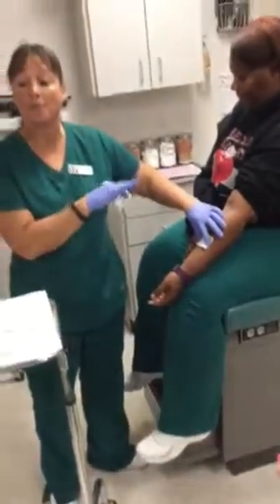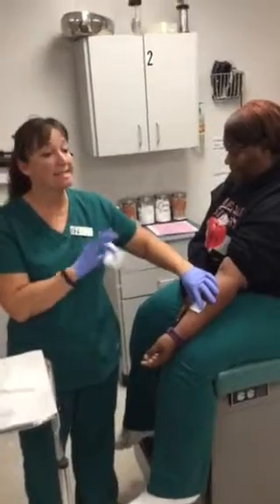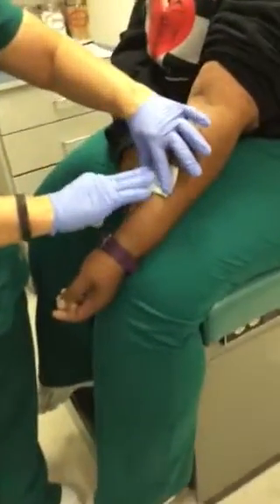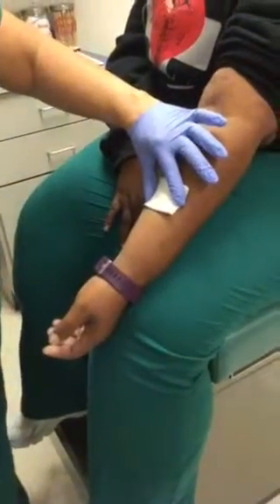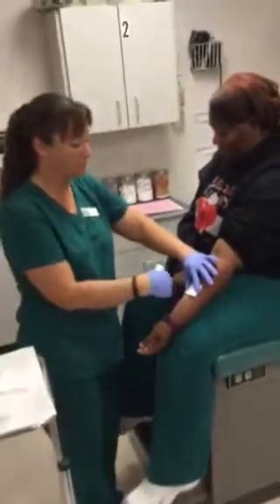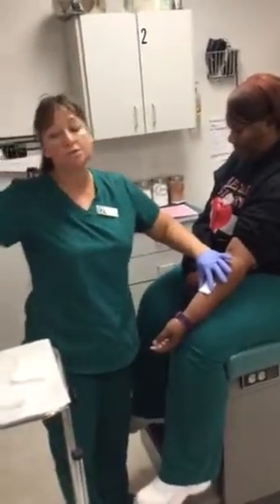The dressing is what goes directly on a wound. A dressing is sterile, it's absorbent, and it's non-stick. Those are things that go directly on the wound. So this is a non-stick pad. It's sterile, I just took it out of its container, and it's what's going to go directly on the patient's wound. So now the bandage is what holds the dressing in place.